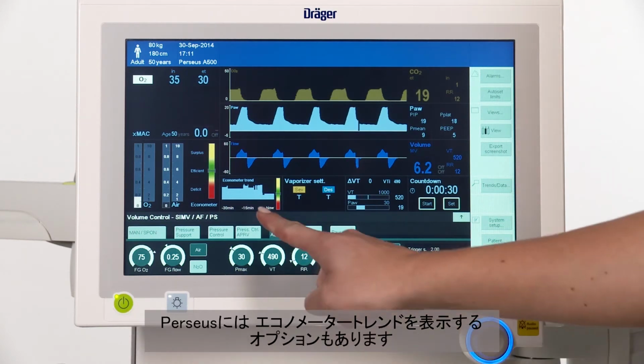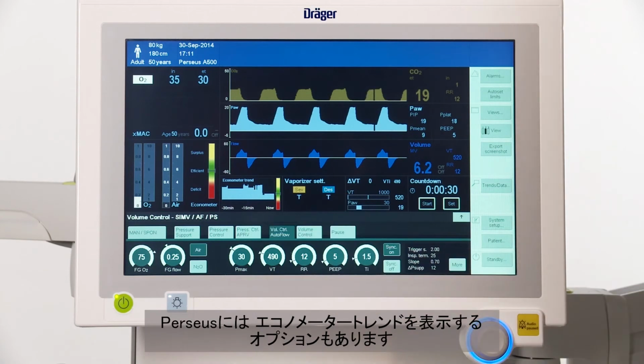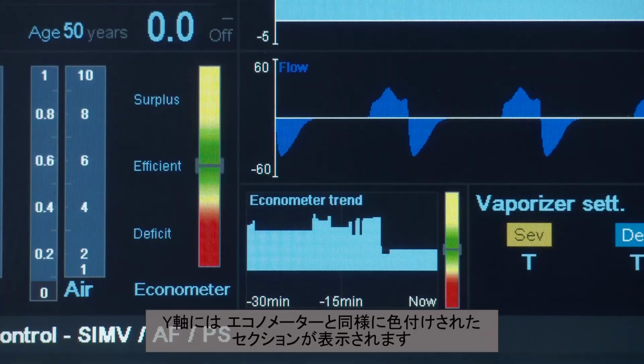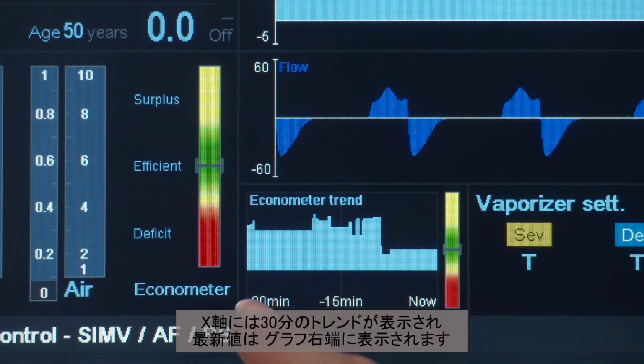As an option, Perseus can provide an econometer trend as well. The y-axis shows the same colouring of the sections as used for the econometer. The x-axis will give you the 30-minute trend with the current value at the right end of the graph.